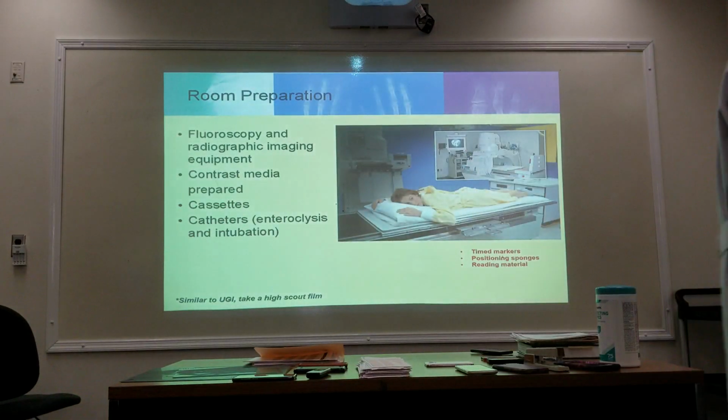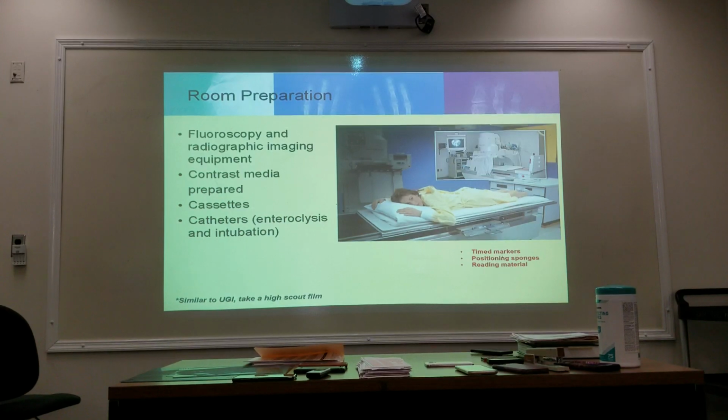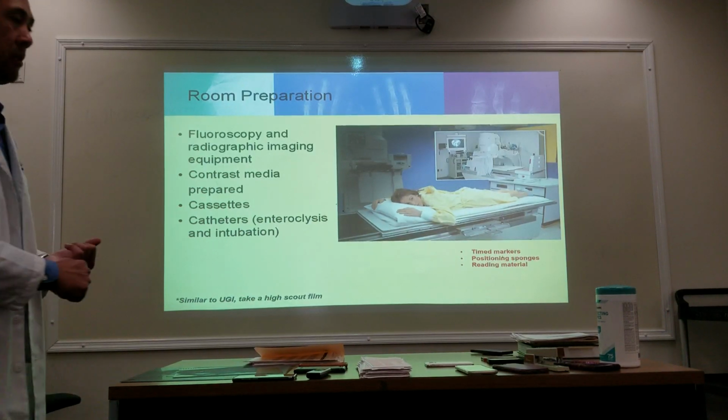Anytime you're doing a fluoroscopic procedure, you guys writing this down? Anytime you do a fluoroscopic procedure, you need to take a scout film. A scout film. It's a preliminary film.